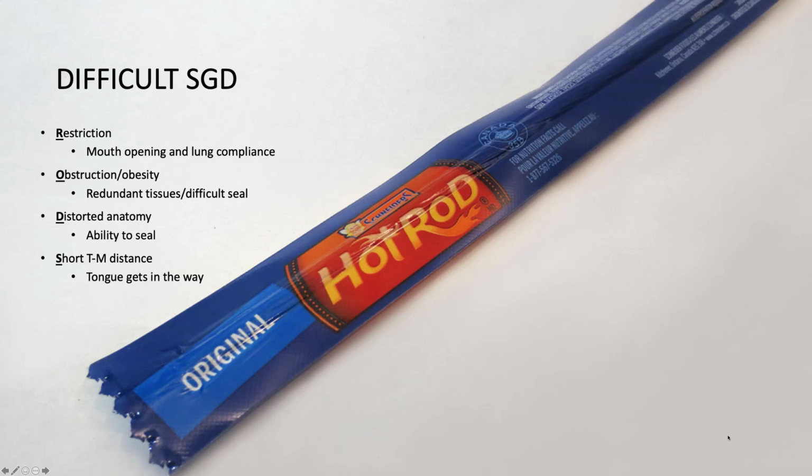Next, going to difficult supraglottic placement. So this is the next step in trying to rescue yourself if you're unable to get an airway. Am I going to have a difficult time placing any of a myriad of extraglottic devices? So in general, mouth restriction is key. So the mouth needs to open wide enough that you're able to insert one of these devices, all of which tend to be rather bulky.